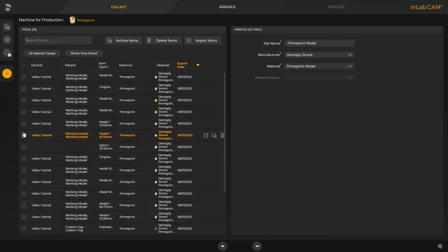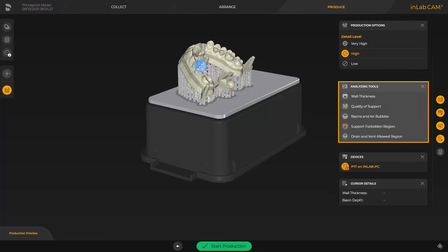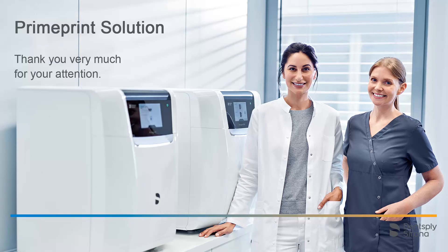Fast Track will take you directly to the last phase, Produce. In this case, the InLab CAM software automatically positions and orients the print object on the build platform and also defines the support structure automatically. Detailed information about the InLab CAM software can be found in a different video tutorial. We click the double arrow and can finally modify the detail level in the window under Production Options and analyze the print object with the Analyzing Tools. To start printing, we tap the green area labeled Start Production. Thank you very much for your attention. We would like to wish you every success when working with Prime Print Solution.